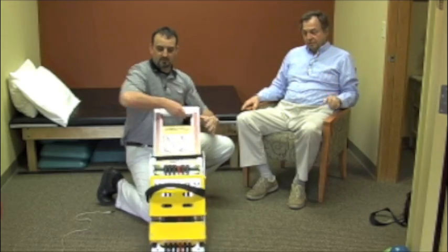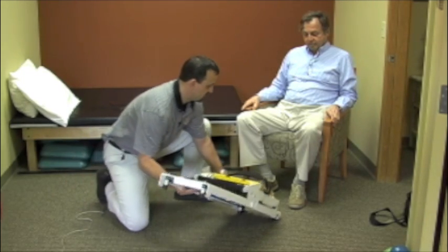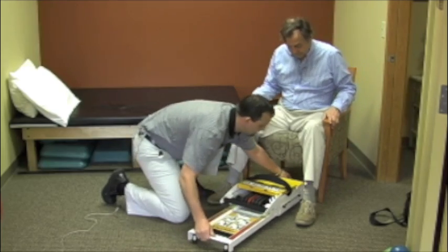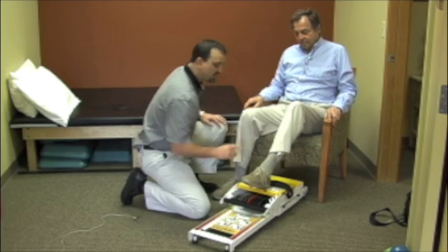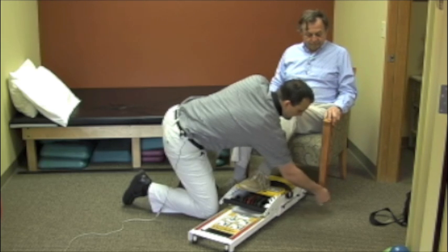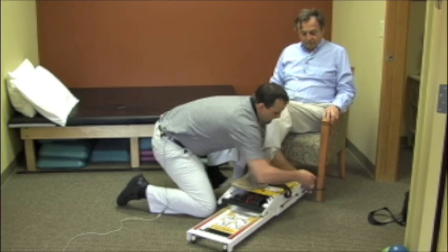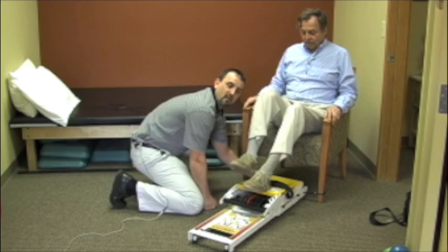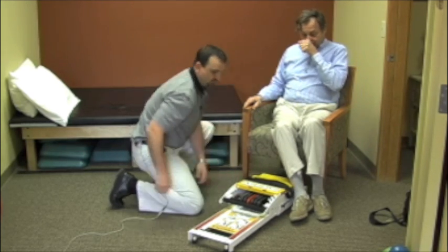We're going to bring this Mini Press in. I'm just going to have you bring your feet apart just a little bit and slide it into place. One feature that's really nice — I'm going to bring your foot up on top of the Mini Press — is this piece has an attachment point coming off here that we can bring around and attach and secure to a chair or a plinth or another surface to secure the Mini Press so it doesn't slide all over.